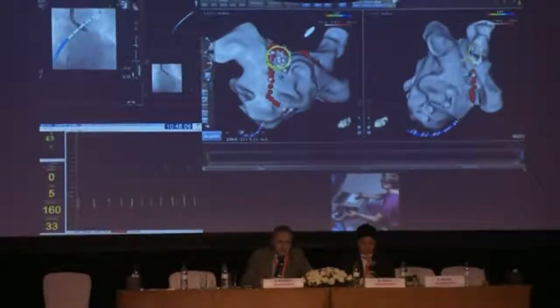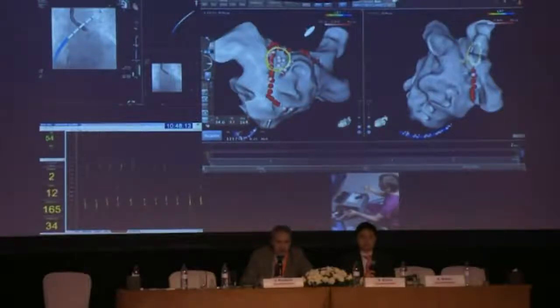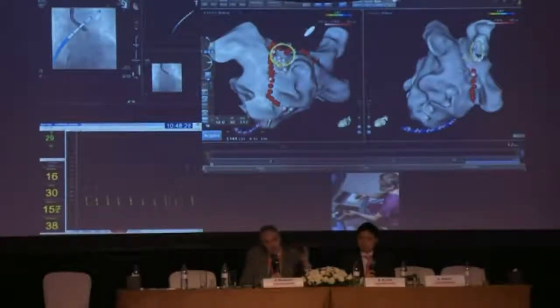really careful definition of anatomy, particularly if you've got really fine control of the catheter position, as you do with the robot. Yeah, and then also if you use this FAM mapping, or if you use NAVEX alternatively, because it can be used both, you can then see the representation difference between the ridge if you manually pull back and with the robot.